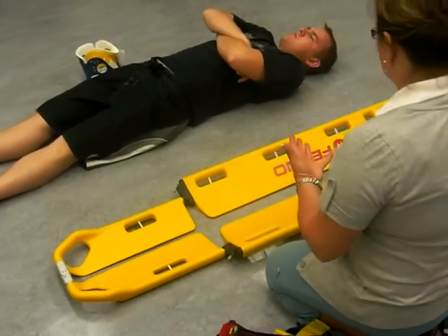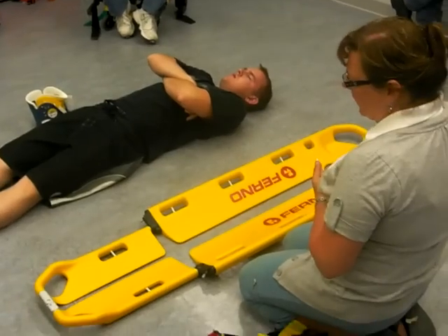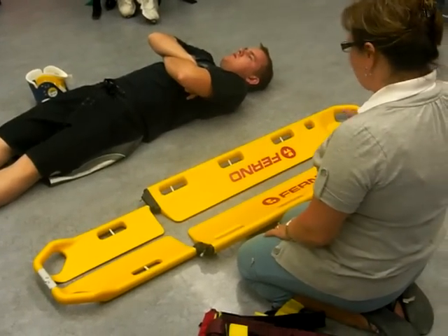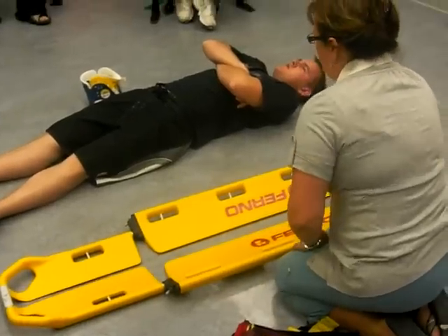This here is your scoop. It's called a scoop, it's called a Robertson, it's also called a clamshell. So it has three different names. If someone tells you to go get their Robertson, you'll know what it is. Don't bring them back a screwdriver.